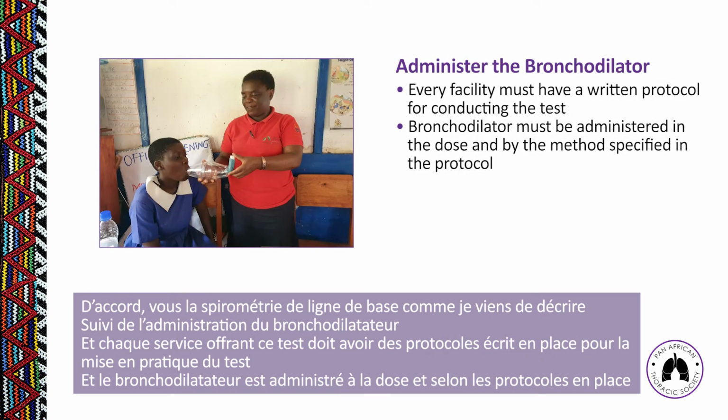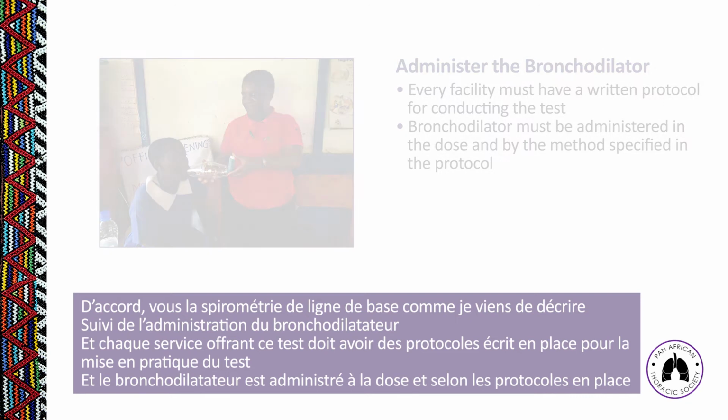So you conduct your baseline spiro, as I've just described. You then administer the bronchodilator. So every facility that conducts a bronchodilator responsiveness test must have a written protocol for conducting the test, and the bronchodilator is administered in the dose and by the method specified in that protocol.